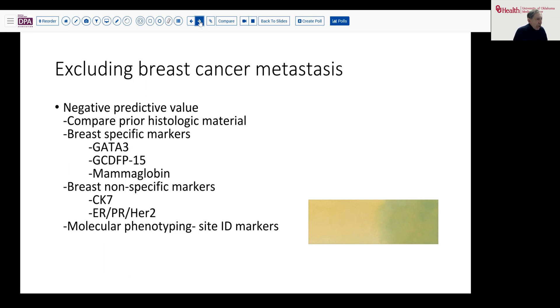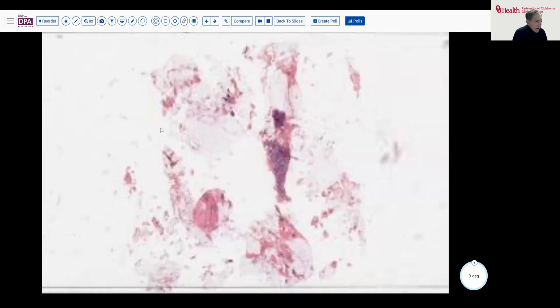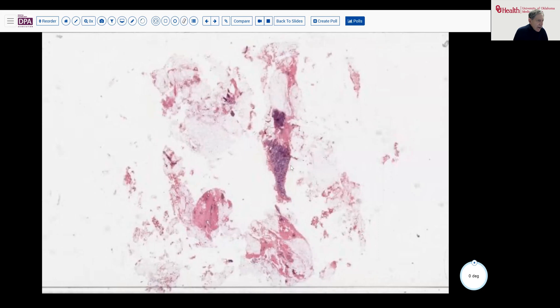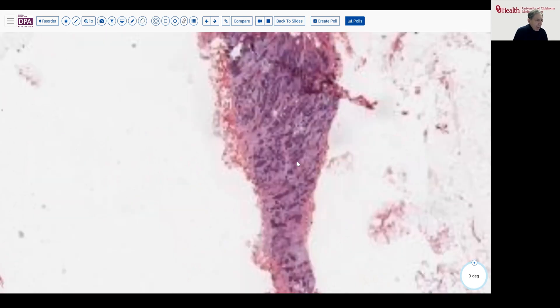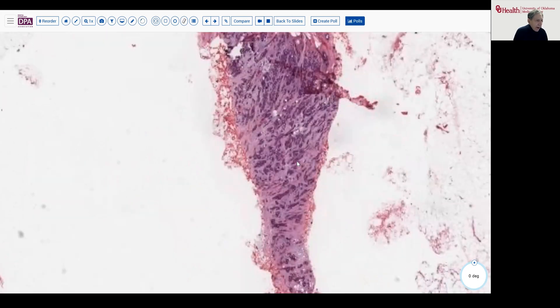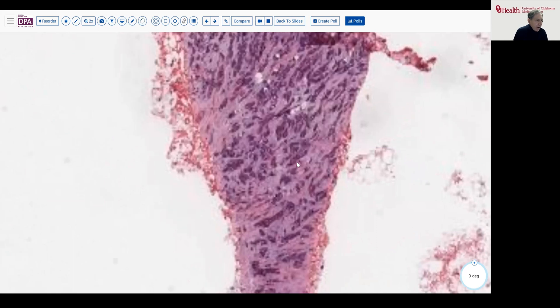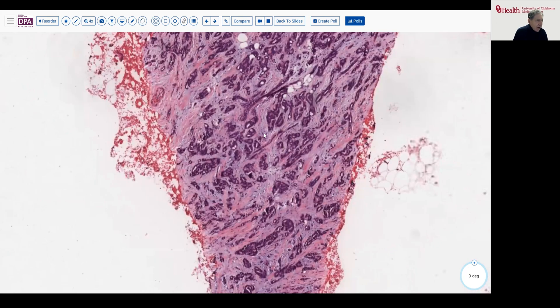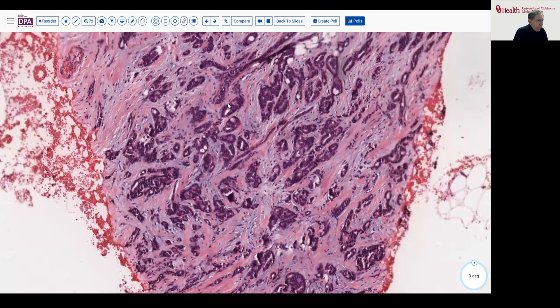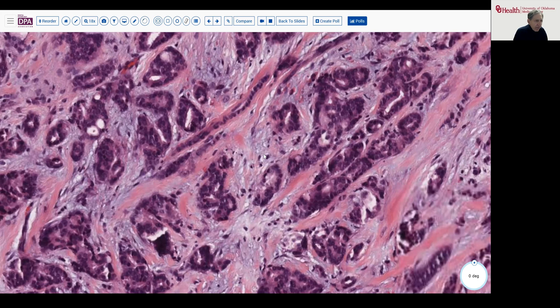So let's do that. Rather than showing you the fancy immunohistochemistry stains, here is the prior breast biopsy. As you can see, it's a needle core biopsy. We have fatty fibrous tissue and here is our tumor. Looking at this tumor at higher magnification, it is tending towards small gland formation — it's really almost a grade one tumor because virtually every one of these nests has a central lumen. The nuclei are fairly low grade.